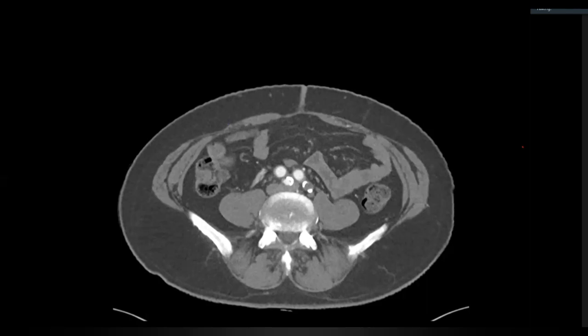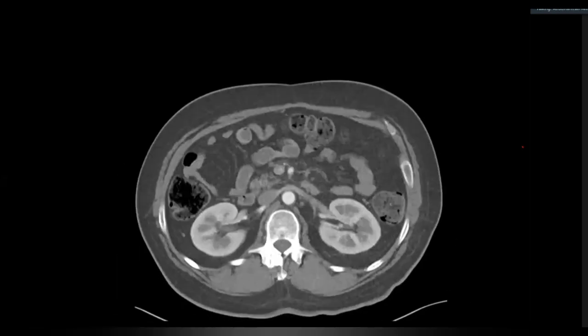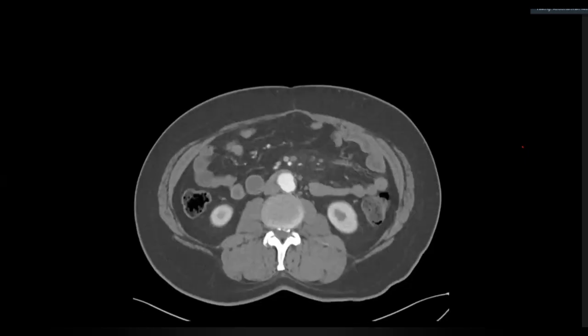I would like to see. What do you want? Do you want me to go up? Do you want me to go down? Pick. Up. Up. Before, okay, this level. Going back up. Okay. So going down.